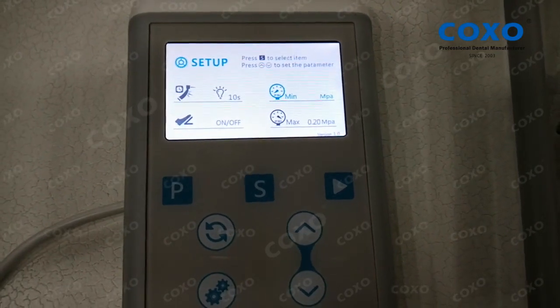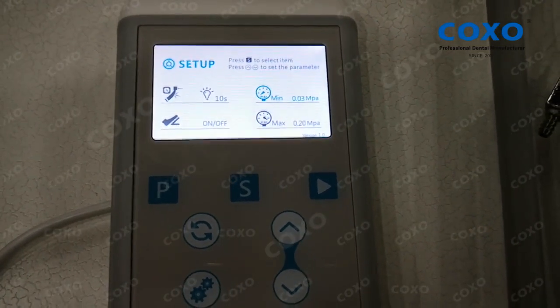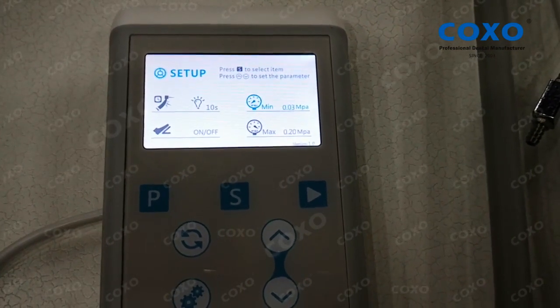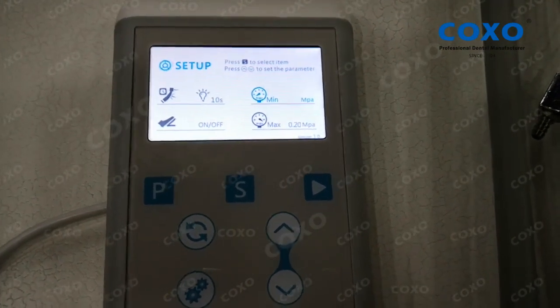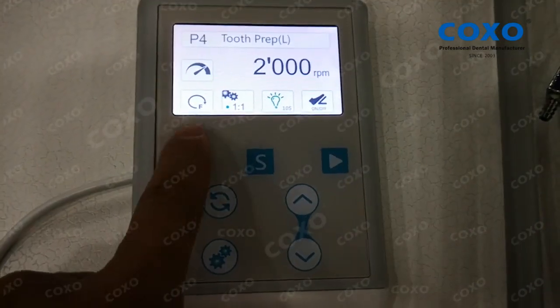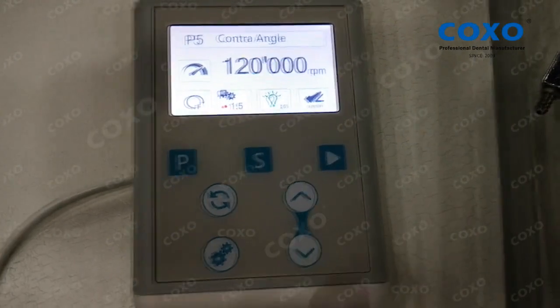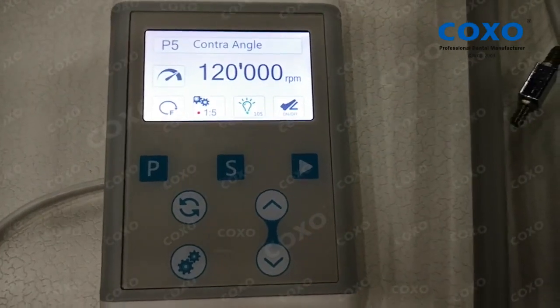This is used to set the pressure of the air which is used to turn on the motor — the minimum or the maximum. All the settings are saved to memory.